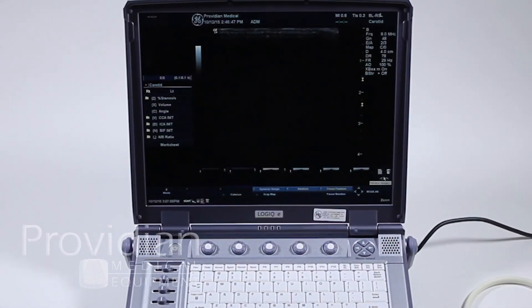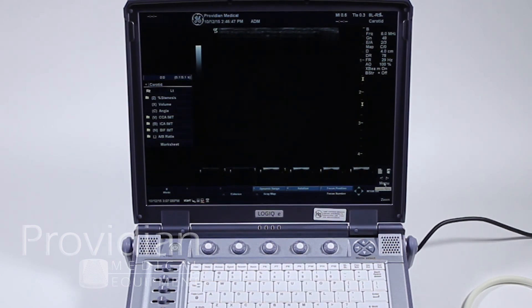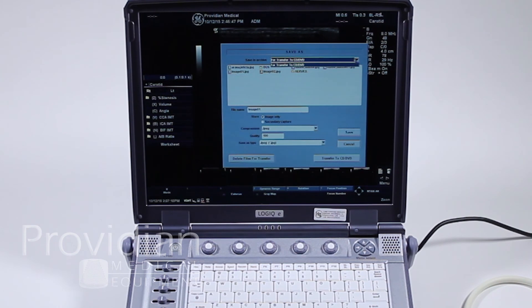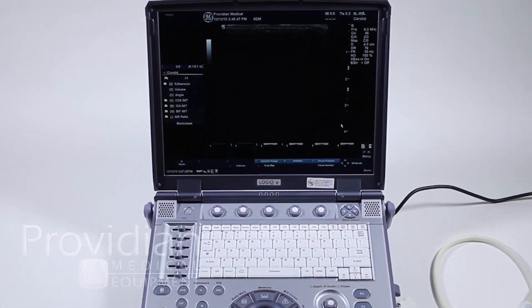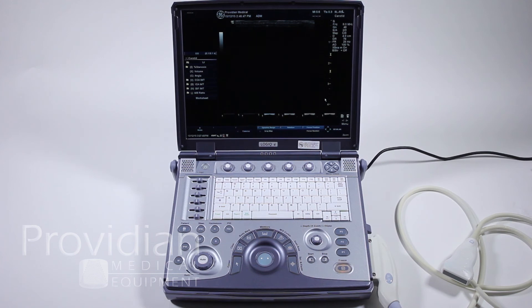You can also save from the clipboard menu — good for saving one or two images at a time quickly to a USB. Click menu, do save as, and you'd be able to select a USB from up here and choose the image, transfer to DVD, or go to that USB by selecting at the top. I'll go ahead and click cancel. There is a video later that goes through the various exporting options available on this machine — it's not necessarily straightforward and actually kind of complicated, so make sure you view that video if you're looking to export.